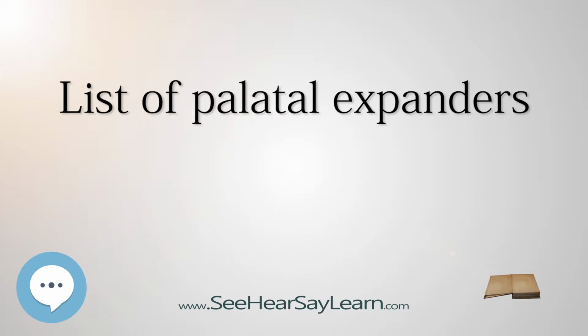an acrylic palatal coverage is added to the appliance. They believe that forces are dissipated through the mucosa and teeth. One of the disadvantages of this type of appliance is it leading to irritation of palatal mucosa.